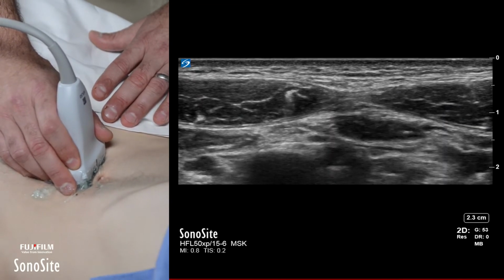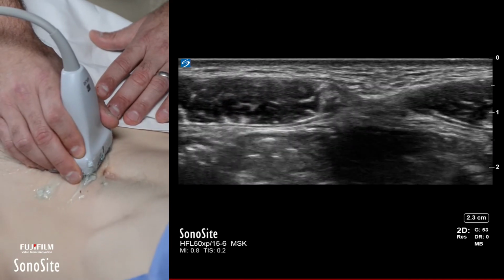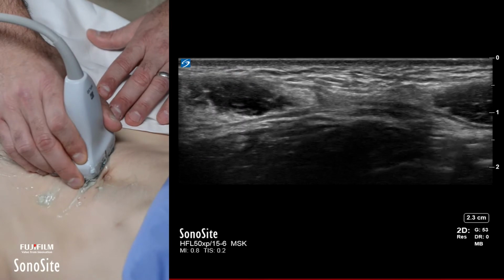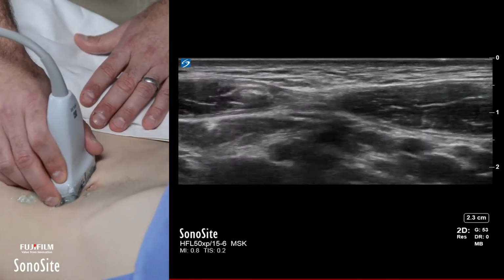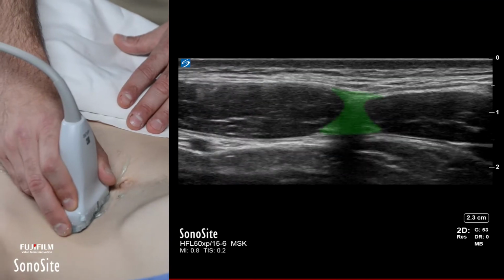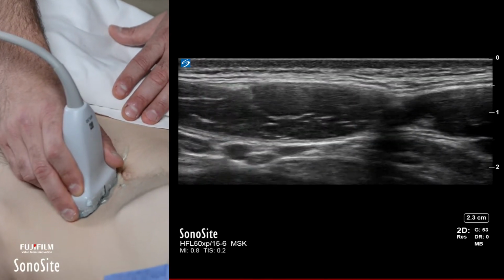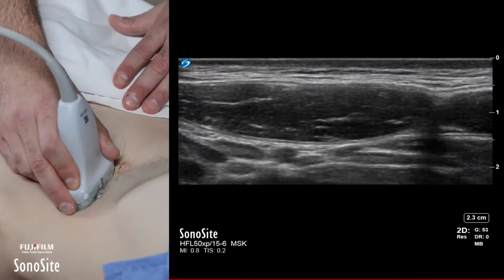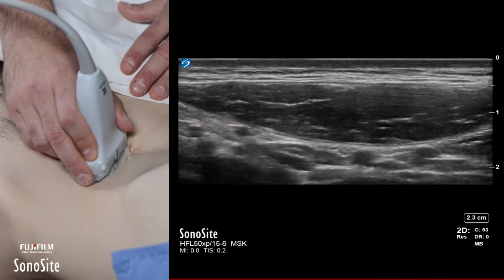Go ahead and do another stomach crunch. Go even more intense if you don't mind. I want to see those muscles really, there we go, and come back down. And then I can go out more laterally to see the linea semilunaris. So I can see the entire medial and lateral boundary of that rectus abdominis muscle.